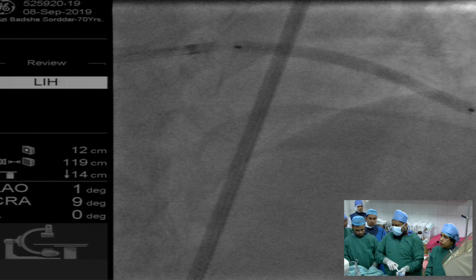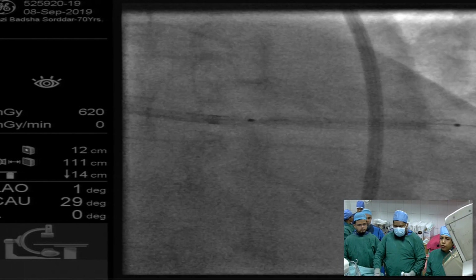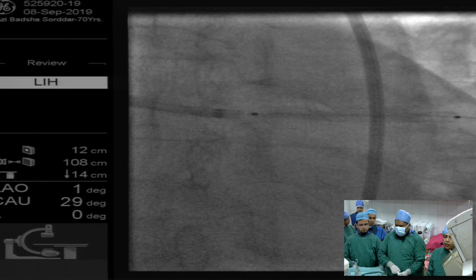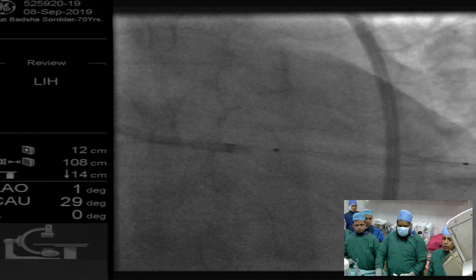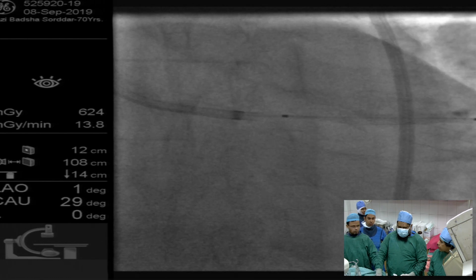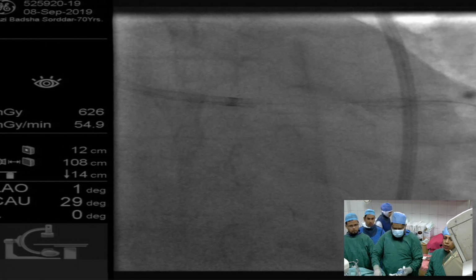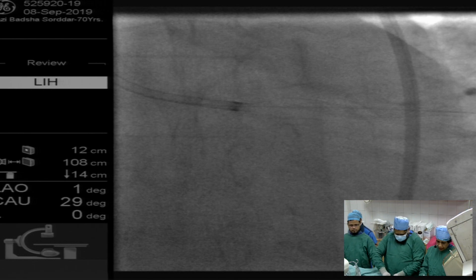It's not going to tolerate long times of ischemia. So for left main, your inflation times should be as short as possible. And another thing is keep the dye dilute. Do we go up with this, or we can take a smaller? We take a smaller NC balloon and post dilate the entire length.